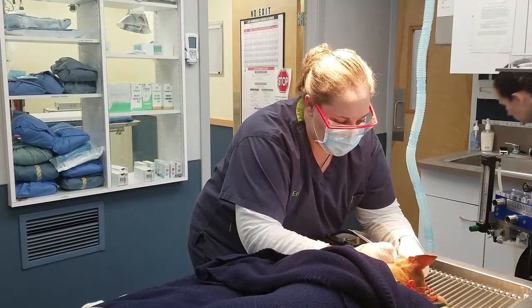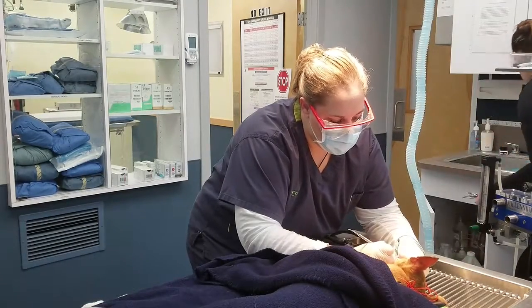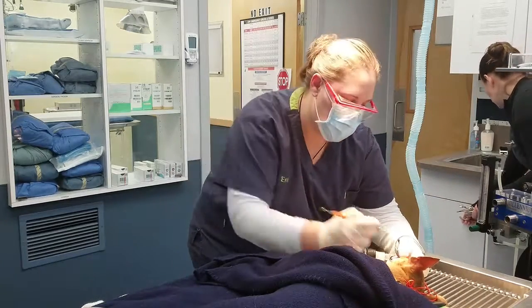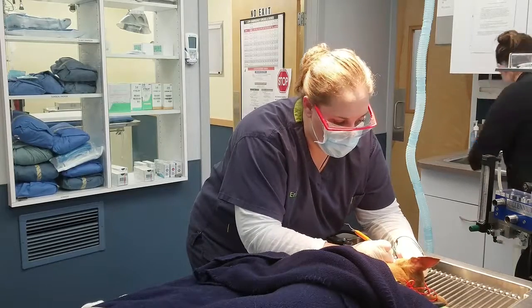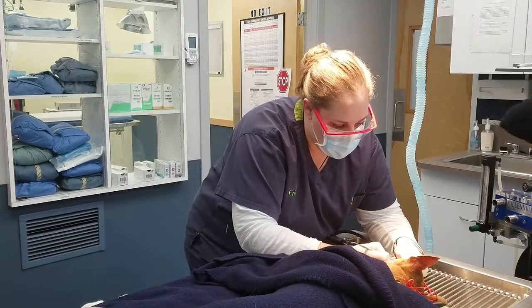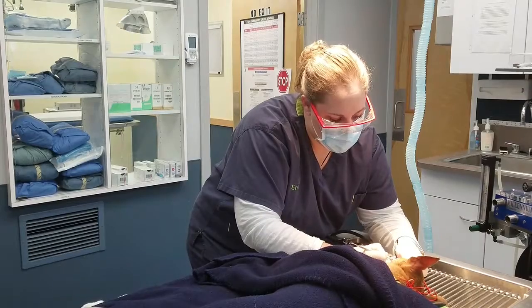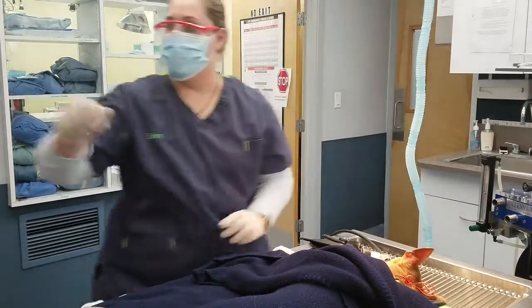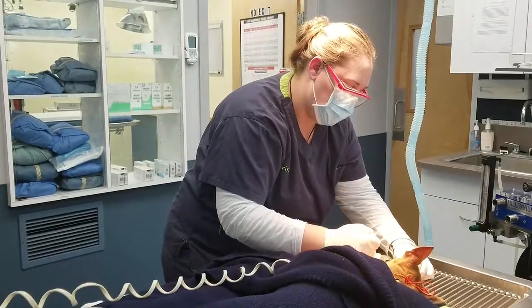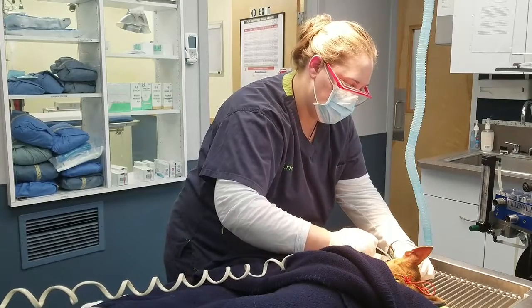This is something that can be done with every patient as well. Flush with a little bit of water and air.